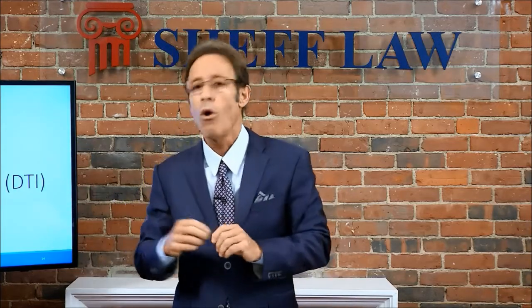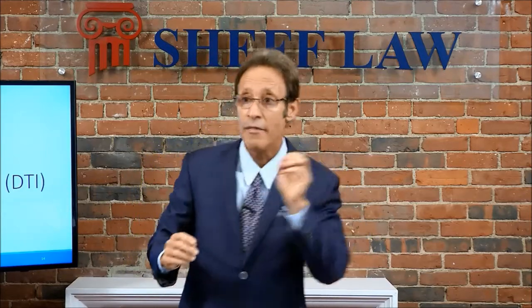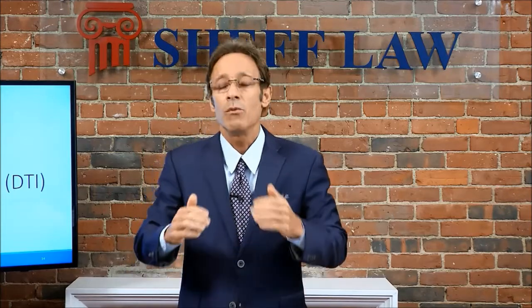At all times, functionally speaking, these water molecules are sort of passing through these axons. Remember that long horizontal structure. It's kind of like a highway for these water molecules, and they like to travel straight through the axon. Now, when those water molecules are obstructed because of the twisting and the damage to those axons, when that gets to be such a problem that the water molecules have to zigzag, then that's an abnormality. We call that zigzag an abnormal FA, or fractional anisotropy.